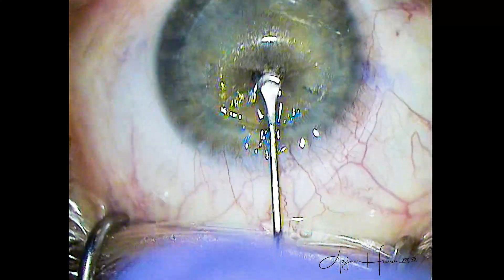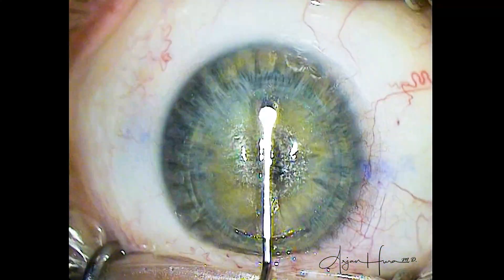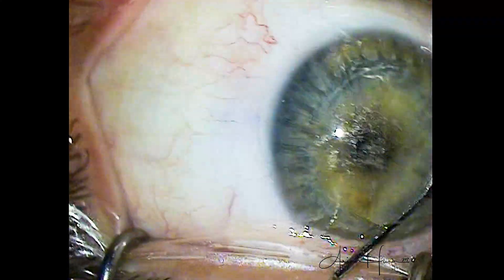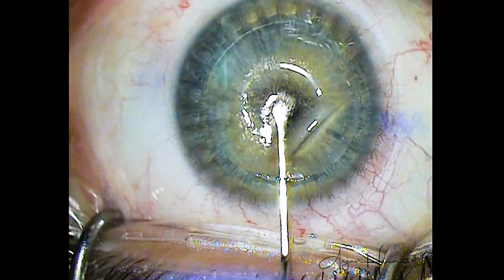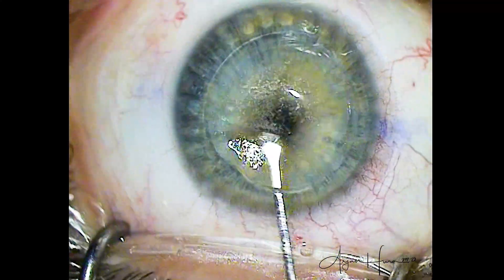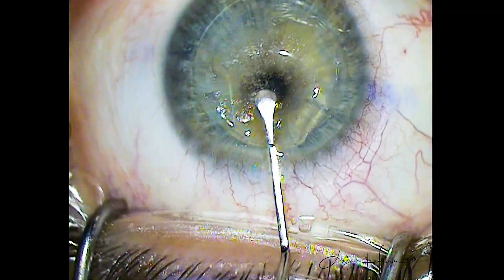You can see there are no subconjunctival hemorrhages. The Visumax is a very gentle laser. It applanates the cornea but does not touch the conjunctiva or the sclera, and the IOP increase from the laser is very minimal. It is rare that I see a subconjunctival hemorrhage with this laser.